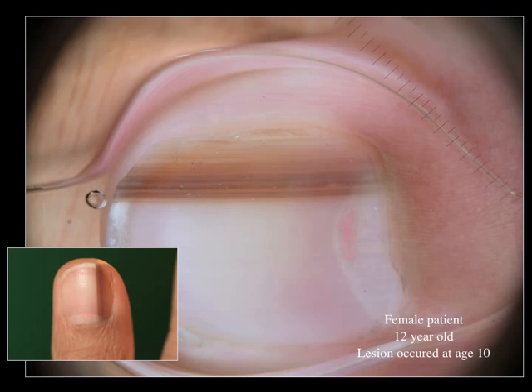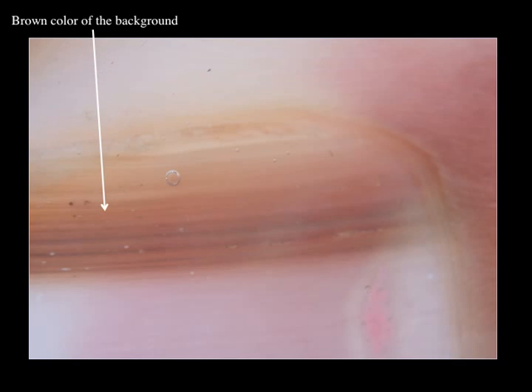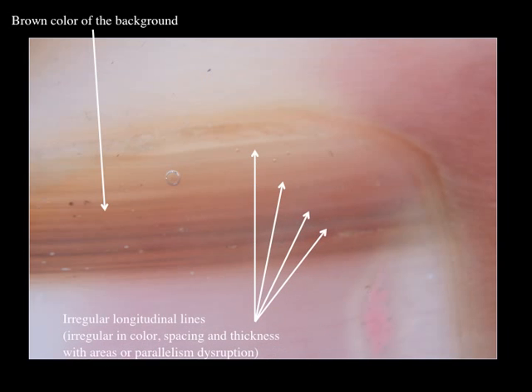This is a close-up of dermoscopy. The background is brown, which indicates a prominent melanocytic hyperplasia in the nail matrix. The longitudinal lines are irregular in color, spacing, and thickness, and there are areas of parallelism disruption. This is the pattern observed in melanoma — yet the patient is only 12 years old.